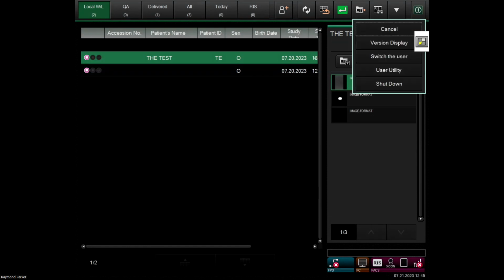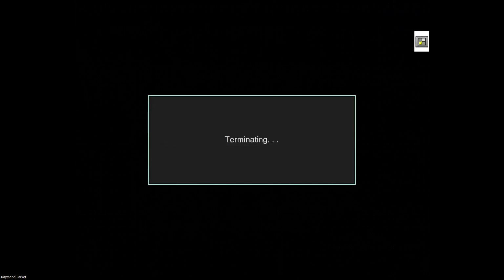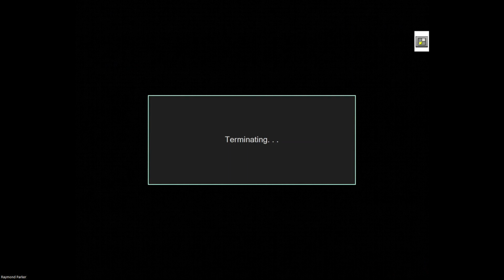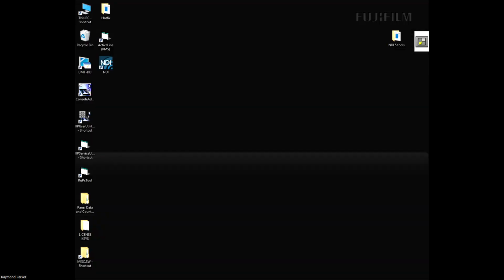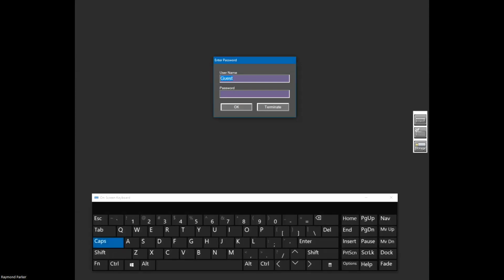So you guys are probably familiar with our user utility and service utility, but as this drops down, I would like to take a moment to describe a few things. I am going to discuss the service utility settings. Not all of our dealers or channel sales do set up security functions, but I wanted to take this opportunity to encourage sites or dealers to include security when necessary or when asked. Setting up the security on this unit is quite easy, and I will go through that process shortly.